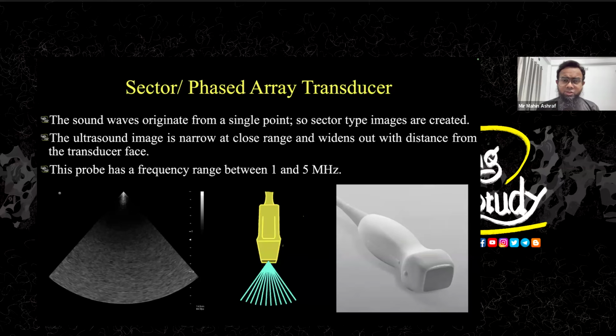Anyway, first come to the sector or phased array transducer. They have an interesting property: they produce sound from a single point. So this is called the sector transducer.